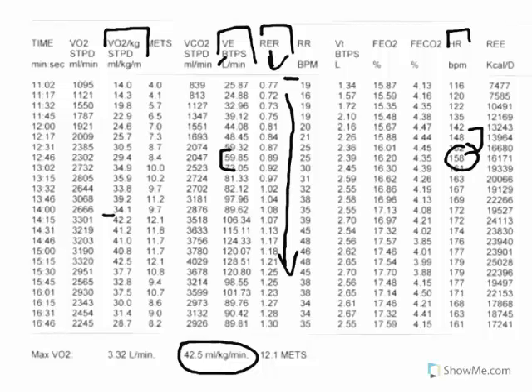All right, so those are the main things that we can get from a VO2 max assessment in relation to someone's fitness level and training status. If you're doing a max assessment for health, then we would want to just look more at signs and symptoms. Did he experience any chest pain? Well, no, he didn't. Did he experience any other things that would be abnormal for someone to experience during exercise?